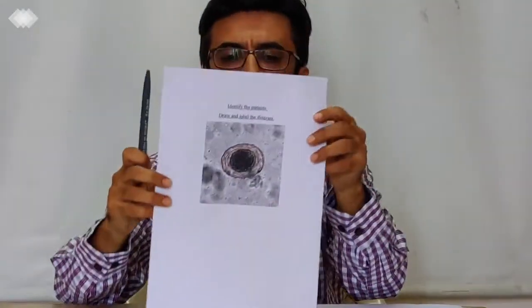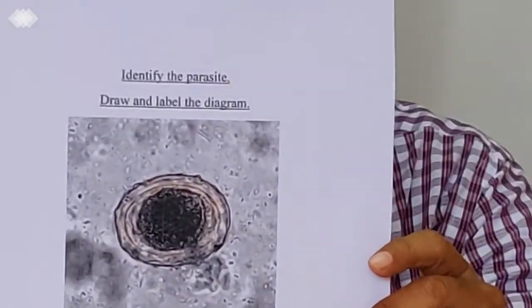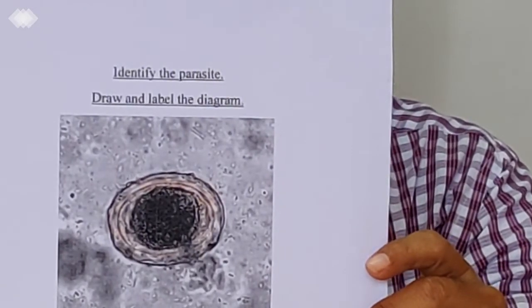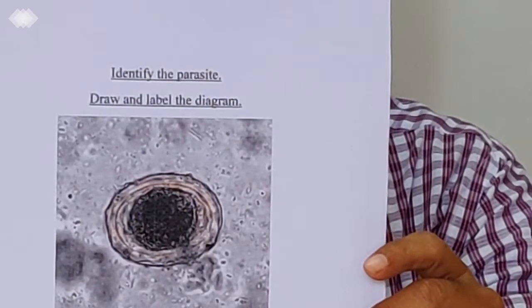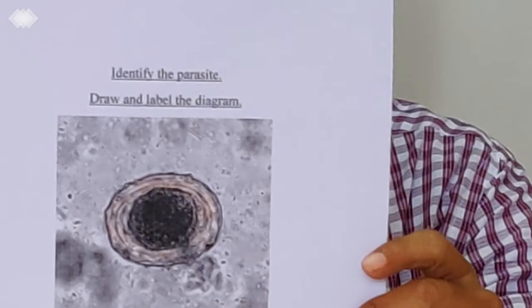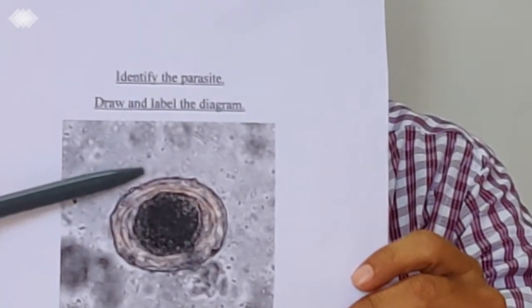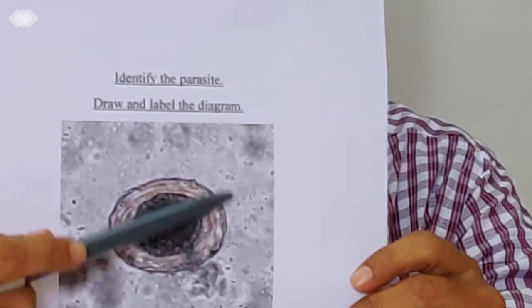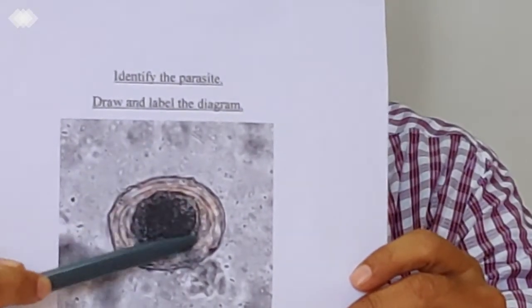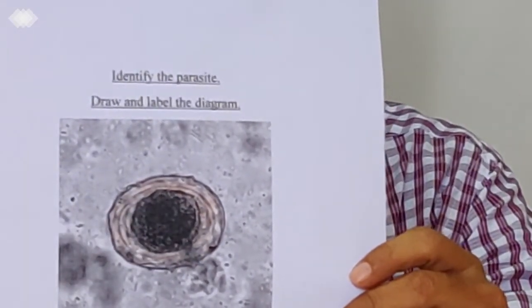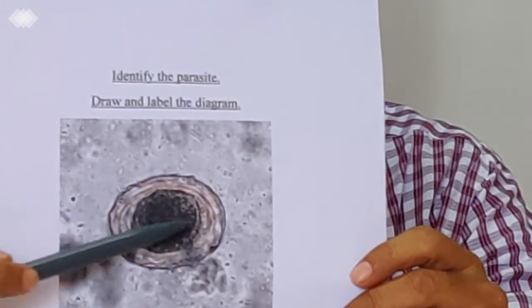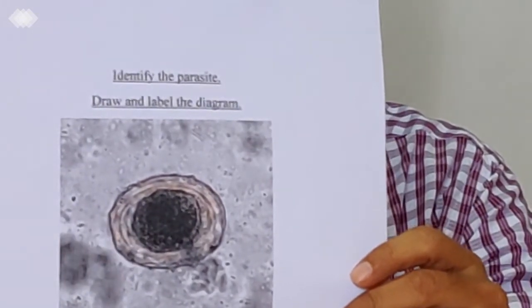If we see next egg, this is the egg of Ascaris lumbricoides, which is commonly seen in the stool preparation. There is a rough boundary. It is yellowish-brown in the color. And you can see, in a fertilized egg, you will see oval inside.